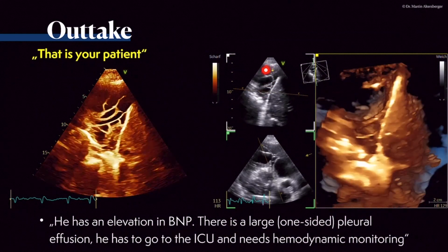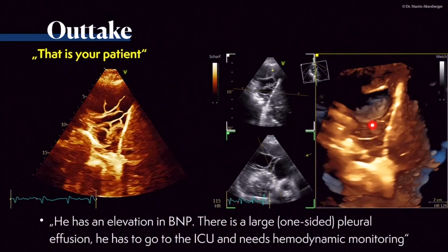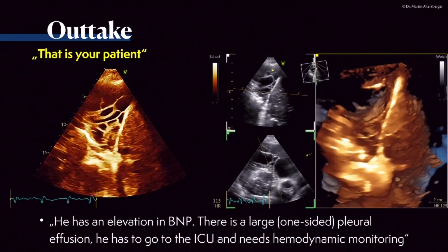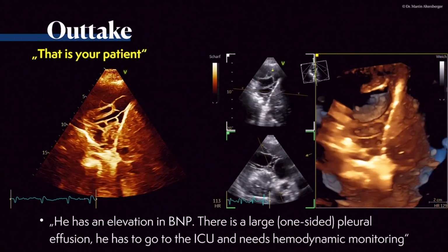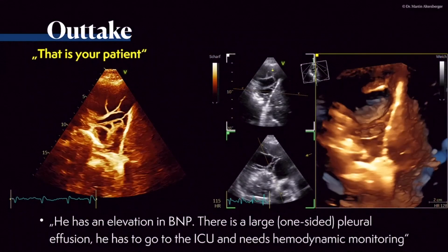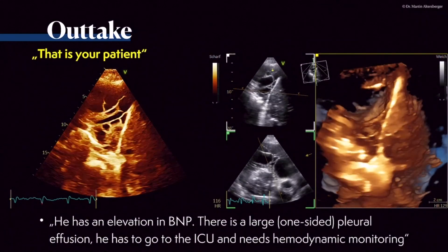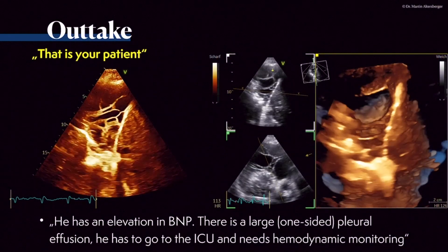Here you see these multiple fibrinous strands, this complicated effusion. Here you cannot relieve the fluid properly. So this is a patient where I wouldn't primarily think about the heart as a cause of this complicated effusion. If you see such an effusion, this is most likely inflammation or, on the other hand, a malignant disease.